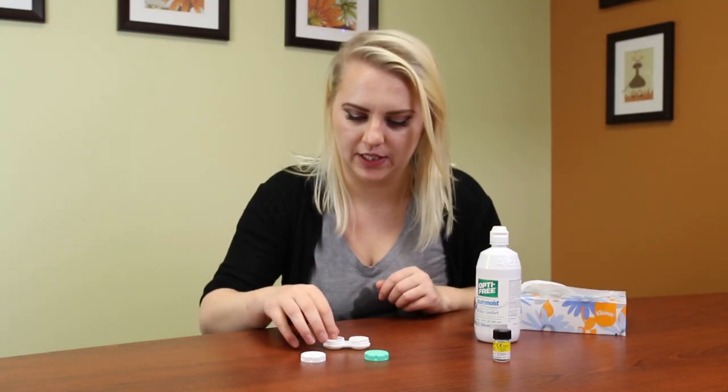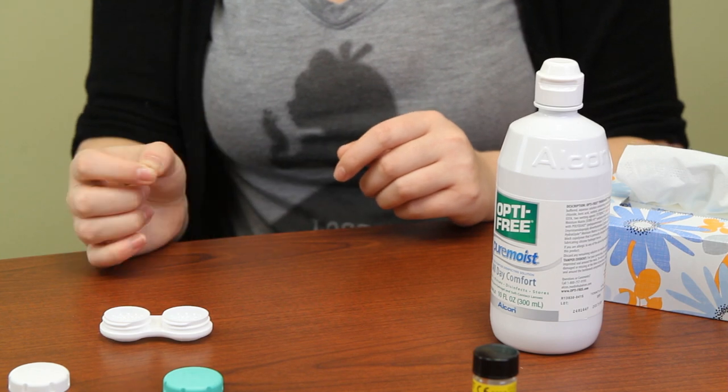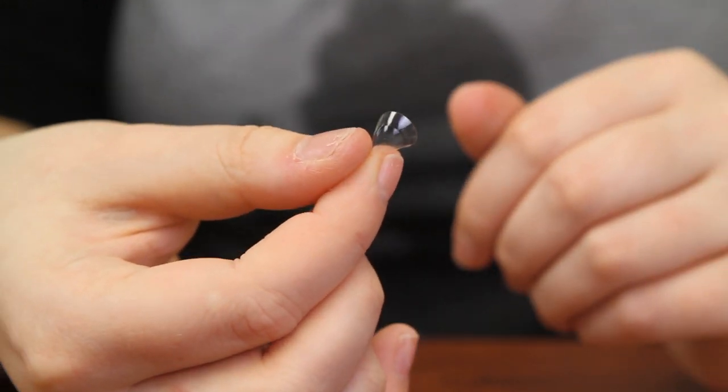When you start, pull the contact lens out of the case. After you get the contact lens from the case you just want to hold it from the thin edge so that way it looks almost like a fan. And then you want to make sure that your fingers are dry and the eyelids are dry.